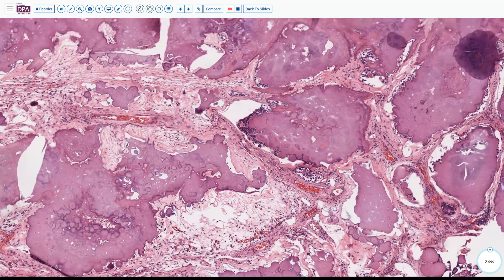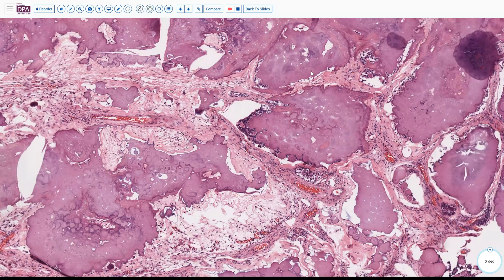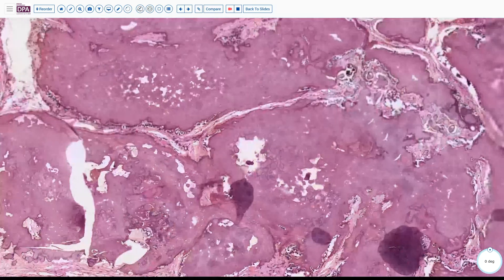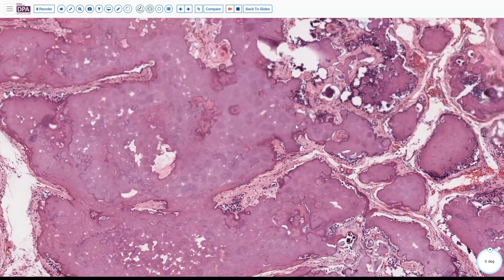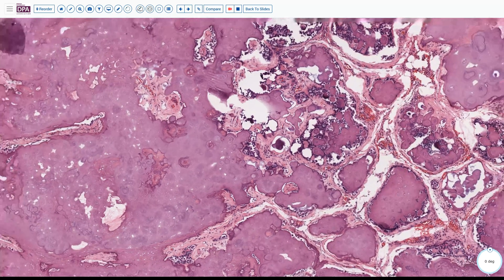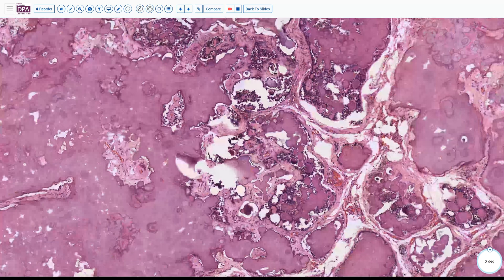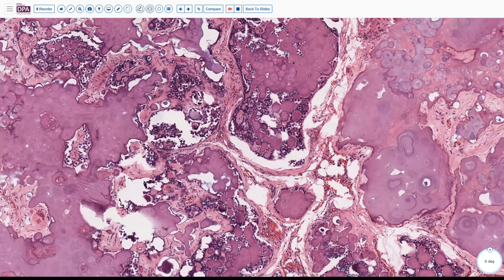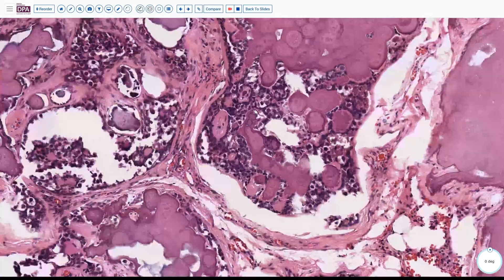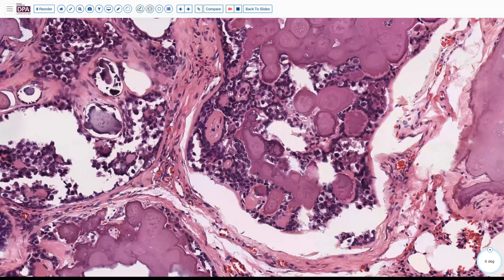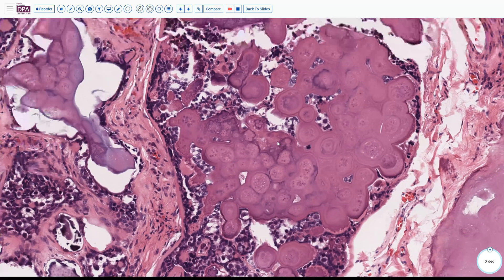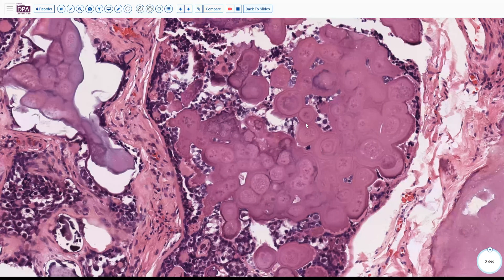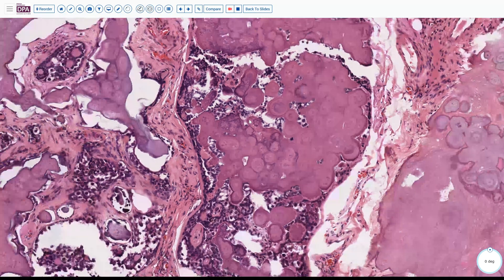Looking at areas of remaining cellularity, we can see these lamellated concretions surrounded by very small blue cells. This looks a little bit reminiscent of Call-Exner type bodies seen in granulosa cell tumor, or perhaps the annular tubules one sees in sex cord tumor with annular tubules. This overall appearance looks very much like a sex cord type of proliferation.